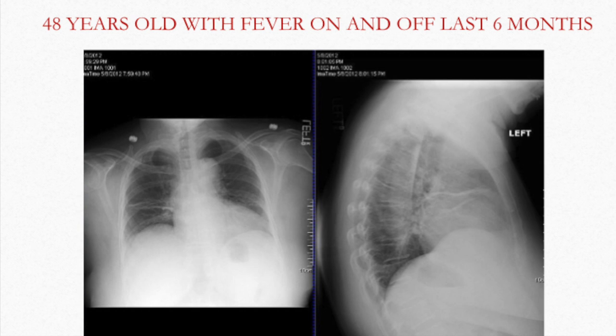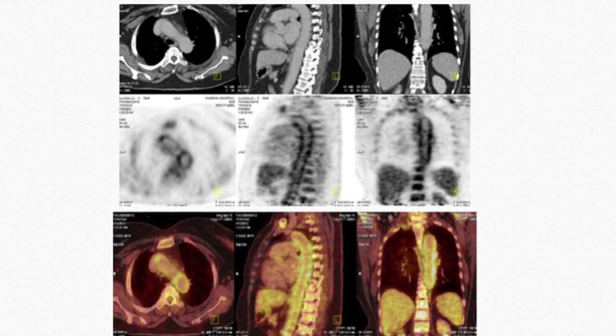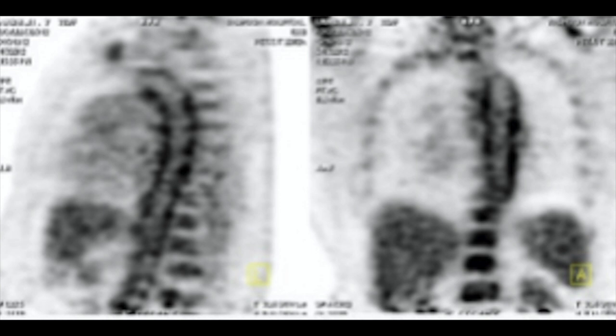This second case is a 48-year-old with fever on and off for the last 6 months. The X-ray showed nothing specific except cardiomegaly and some sub-segmental atelectasis. Because of pyrexia of unknown origin, PET-CT was done, which shows diffuse circumferential uptake along the thoracic aorta, involving the arch and descending thoracic aorta, with minimal wall thickening consistent with aortic wall inflammation — a case of aortoarteritis.